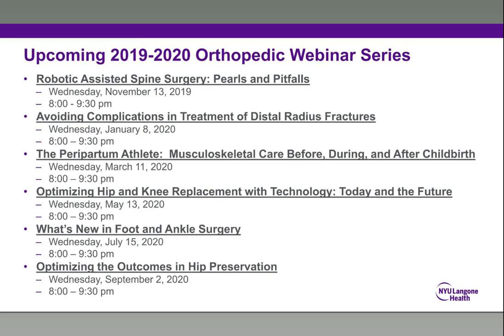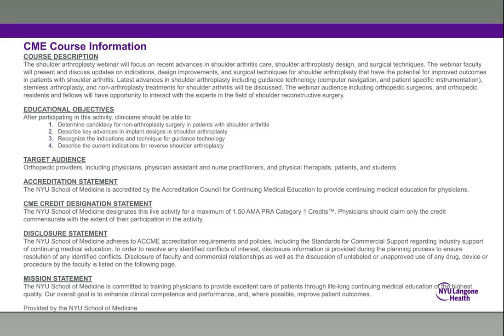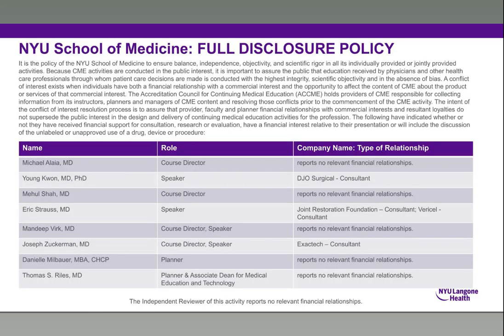And if during the short stem I feel like I've already violated most of the metaphyseal bone, I would either select an impaction grafting, and if I don't like the stability, maybe a little bit of cementing. If not, then go to a standard stem. Dr. Kwon and Dr. Zuckerman, would you do anything different, or would you like to share any other technique that you use to decide between a stemless versus a short stem design?